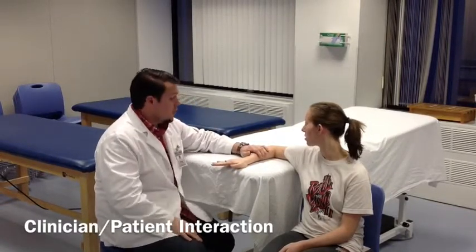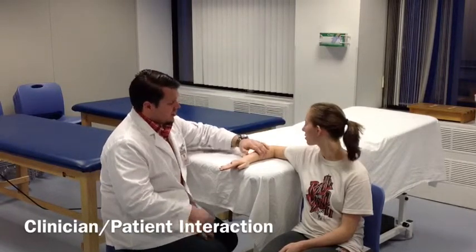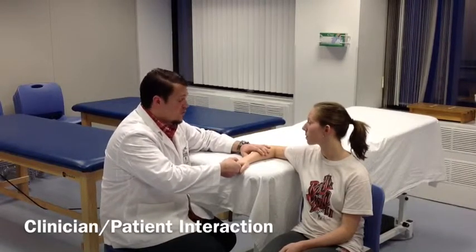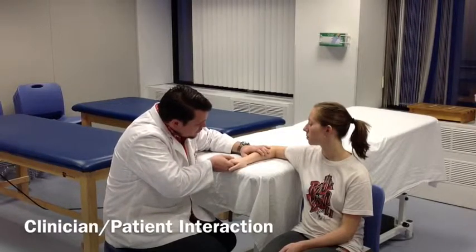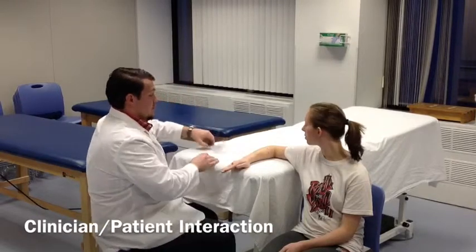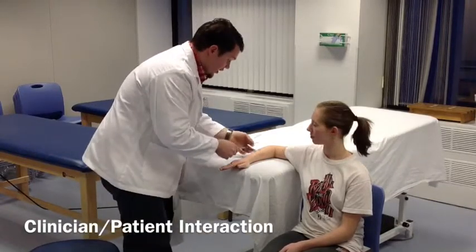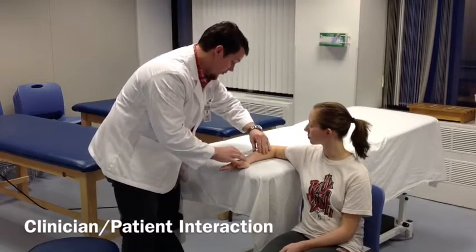As far as I can go. Okay, that looks good. Go ahead and go back to the neutral position. Now I'm going to have you relax that wrist, and I'm going to move this myself to see if we get any additional movement, okay? Okay. The next step is I'm going to take this measurement, so I'll stand so that I can get a better view of the goniometer.